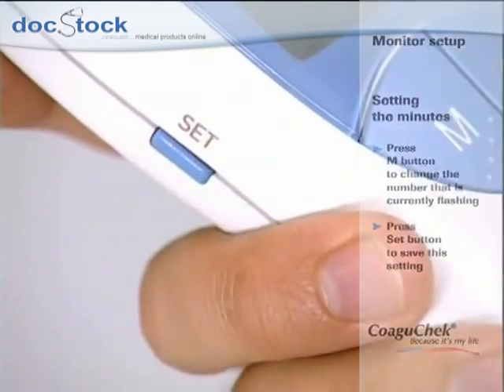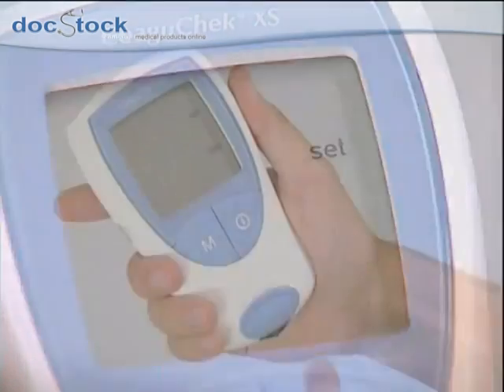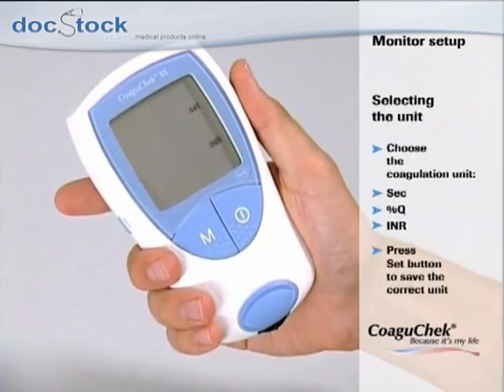It is important to select the right coagulation unit. The COAGUCHEC XS monitor offers you three options: seconds, the Quick value, and the INR value. Please ask your doctor if you are not sure what to select. Press the M button to move through the three options and confirm your setting using the set button.